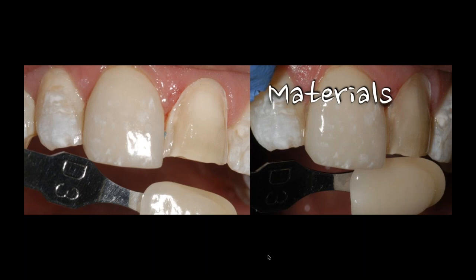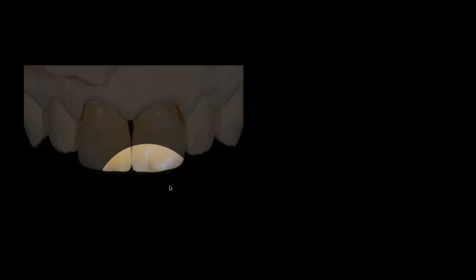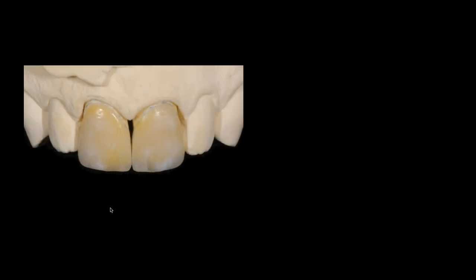So he went back to the patient and told the patient what I wanted to do, and the patient's response was, you know what? I never liked these veneers. I'd be glad to do both of them. So it was kind of a better way if you really got into it. So in the end, I made two veneers. You can see there are refractory veneers on my die at this point with yellow die spacer behind them. And there's a lot of white calcifications to follow what I saw in the natural tooth.